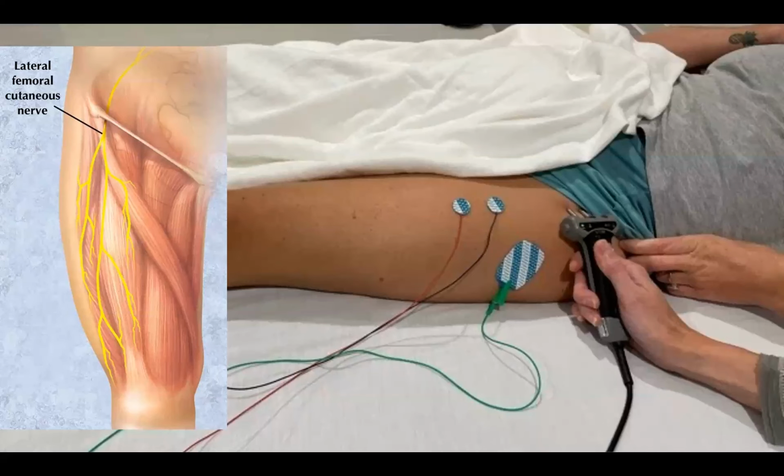To perform the lateral femoral cutaneous nerve conduction study, this is a picture depicting the technique. So the G1 and G2 electrodes are placed in the anterolateral aspect of the thigh. And if you look at the hand-drawn picture of the nerve, you'll note that there are a number of branches. So this is where it becomes technically challenging because you often need to move the electrodes to find the largest branch or the branch that you obtain the best response. We can then stimulate the nerve, usually just underneath the inguinal ligament at the site of the nerve exiting underneath the inguinal ligament.